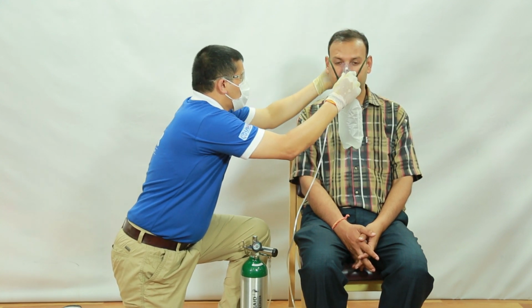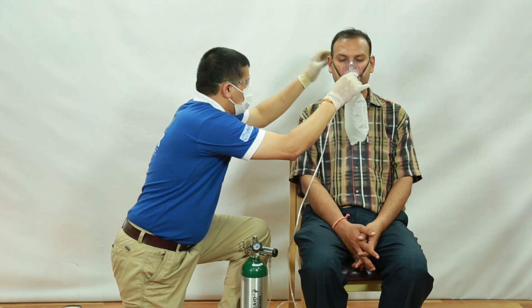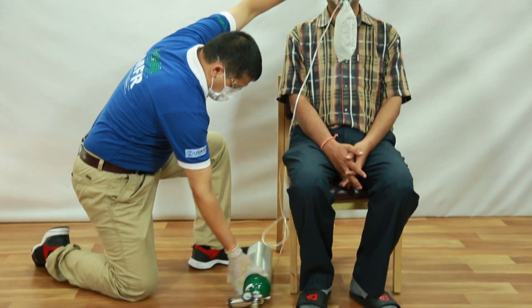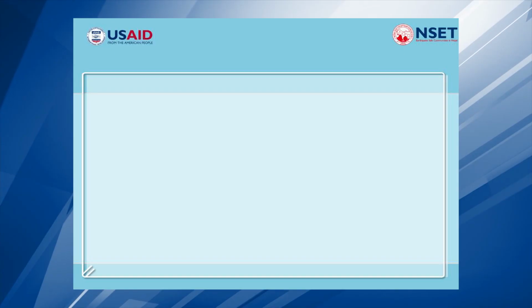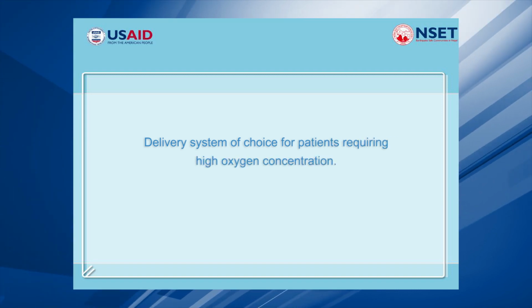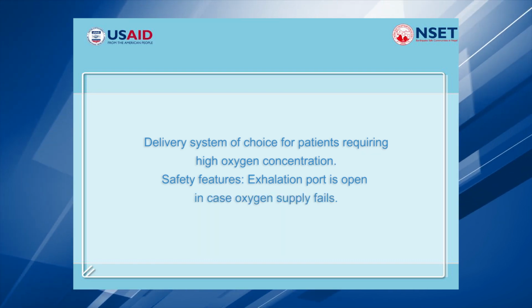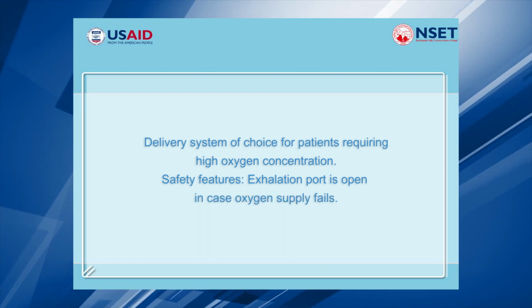Reservoir must always contain enough oxygen so that it does not deflate by more than 1/3 when the patient inhales. Must maintain proper flow rate. Delivery system of choice for patients requiring high oxygen concentration. Safety feature: exhalation port is open in case oxygen supply fails.